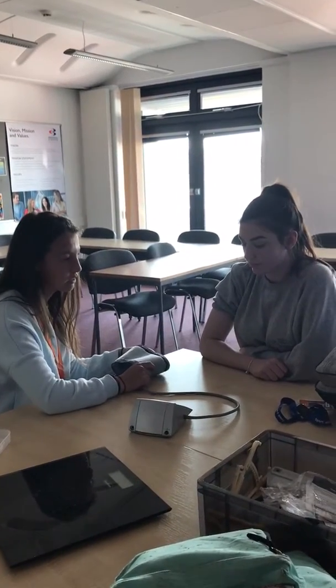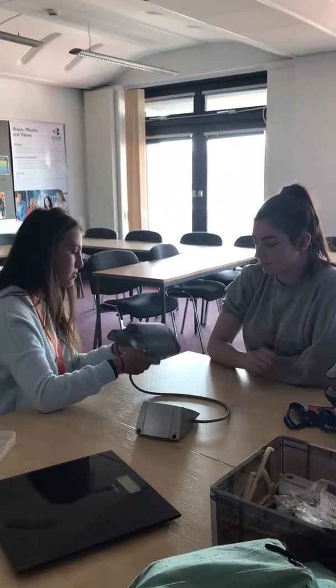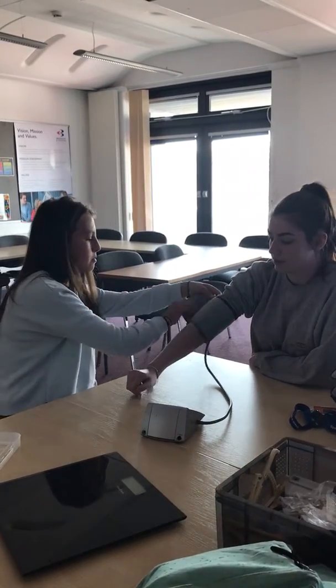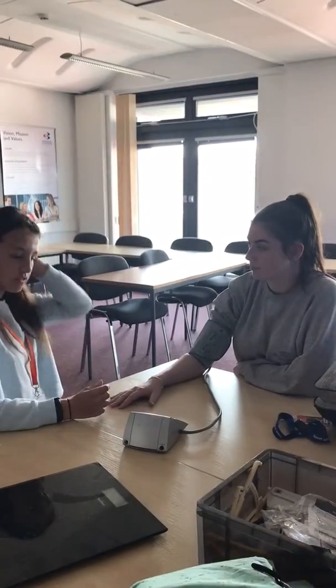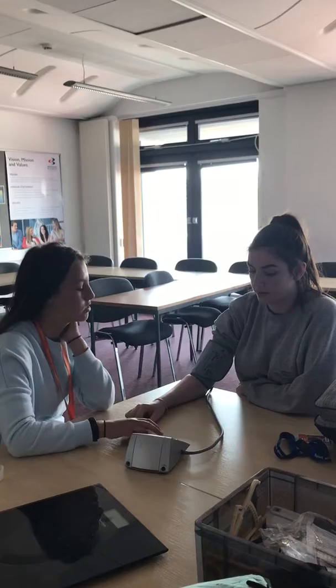So this is blood pressure, and including in blood pressure, there'll be heart rate on the screen, so you've done the two tests there. I'm just going to set this up on your arm. Once I press start on your screen, it's going to inflate, and after a few seconds when it does reach your blood pressure, it will deflate. So if you do feel any discomfort, just tell me at any time.